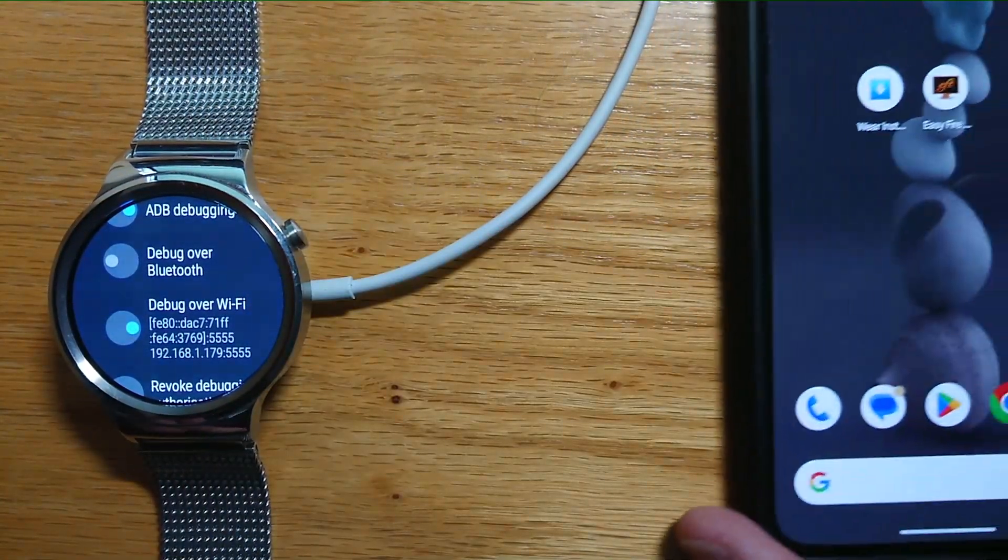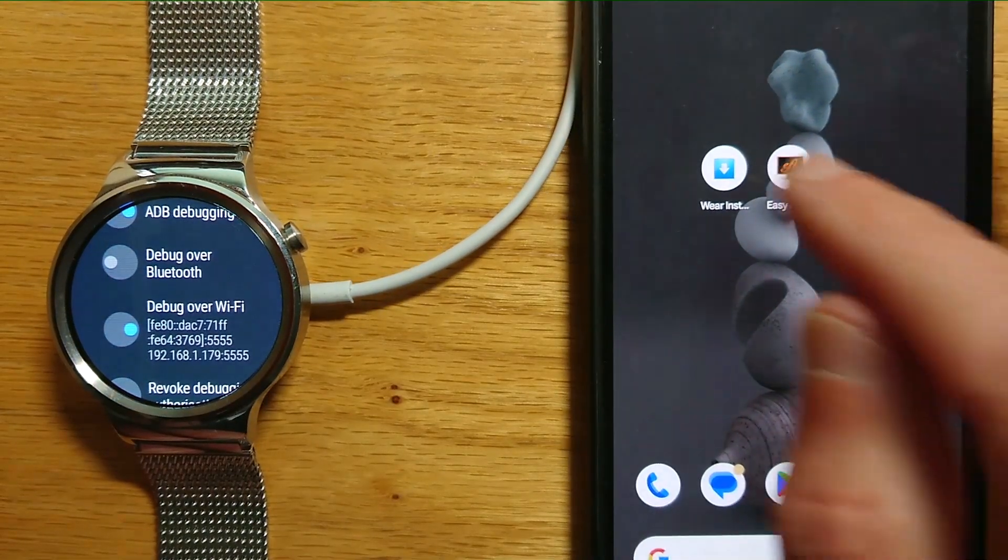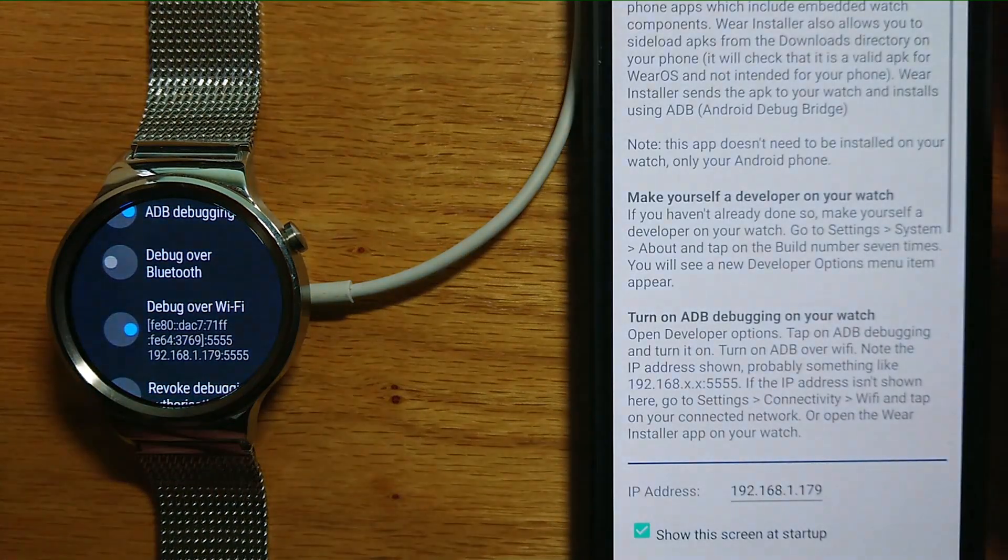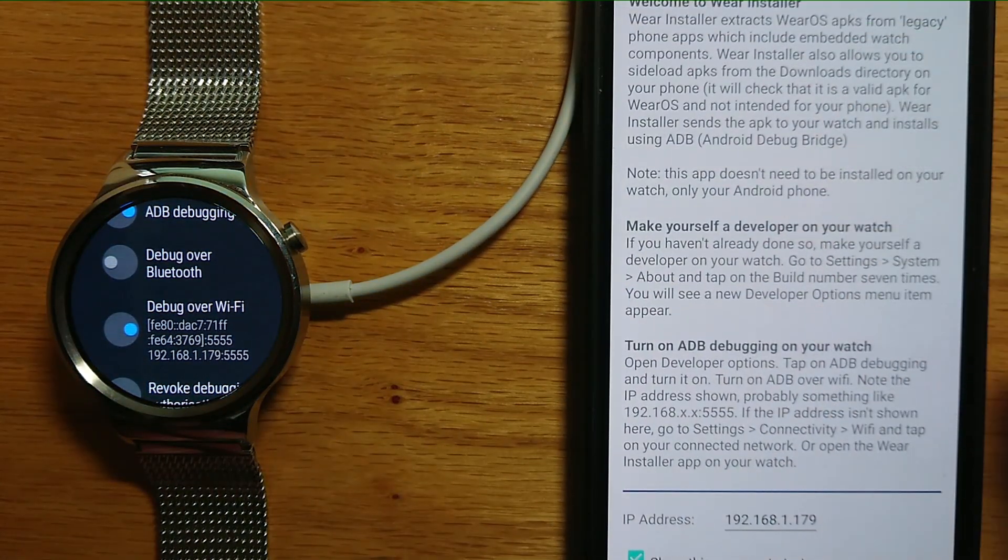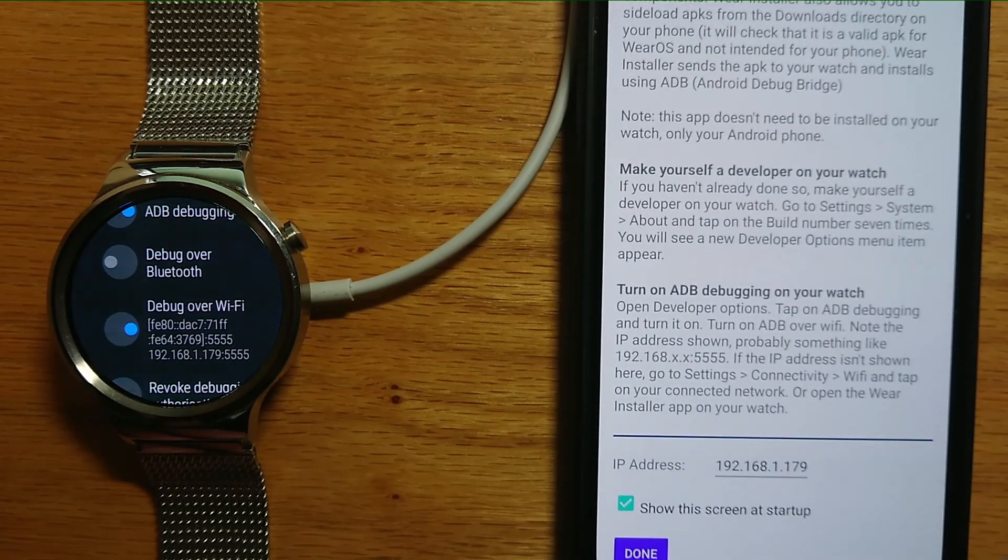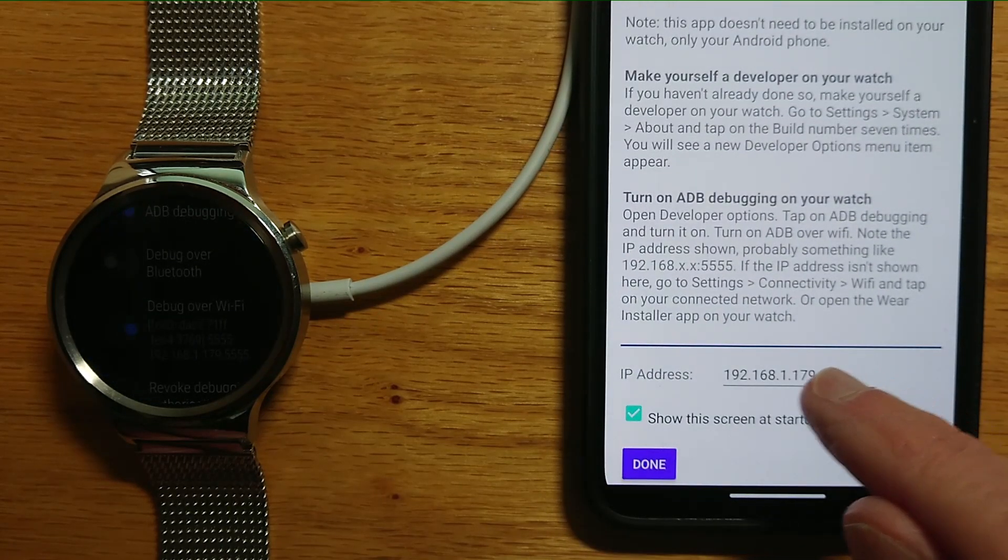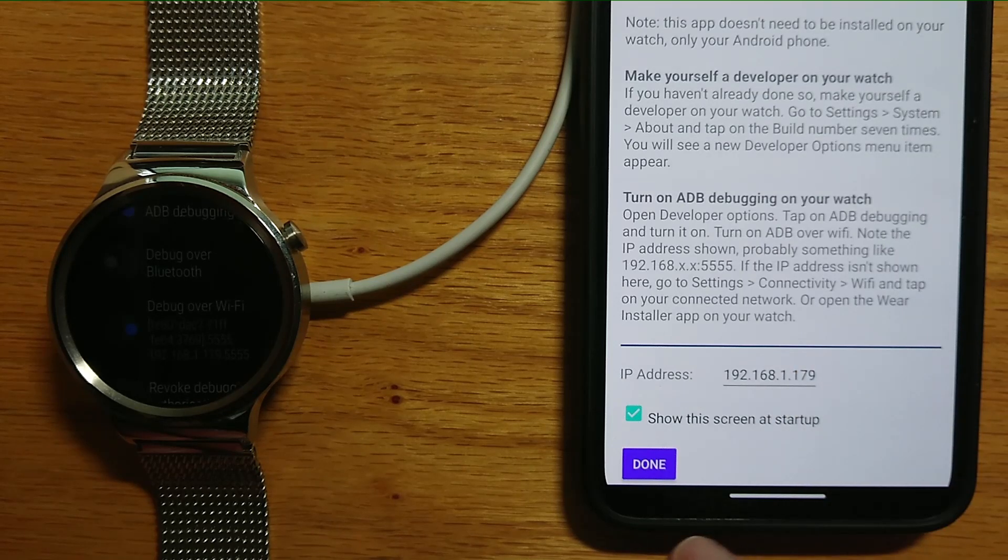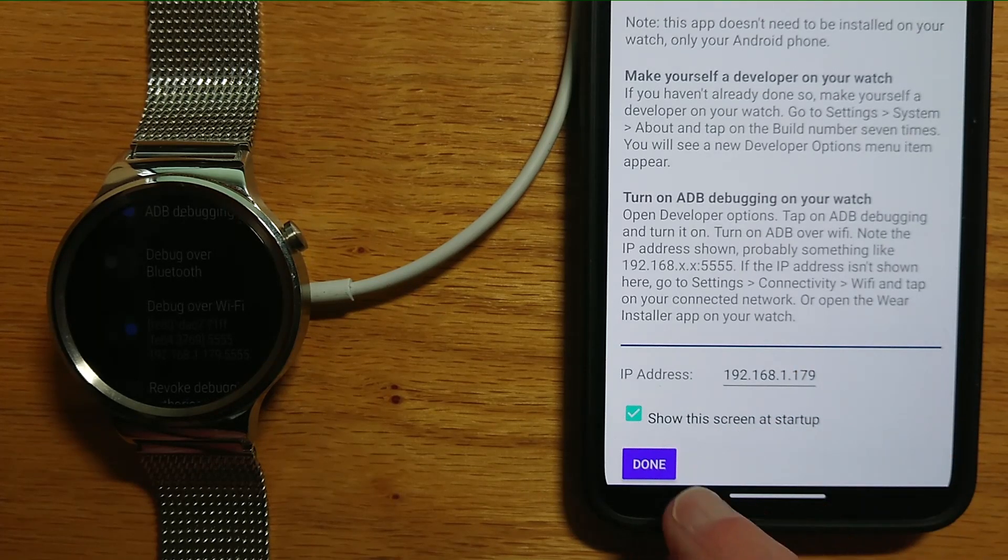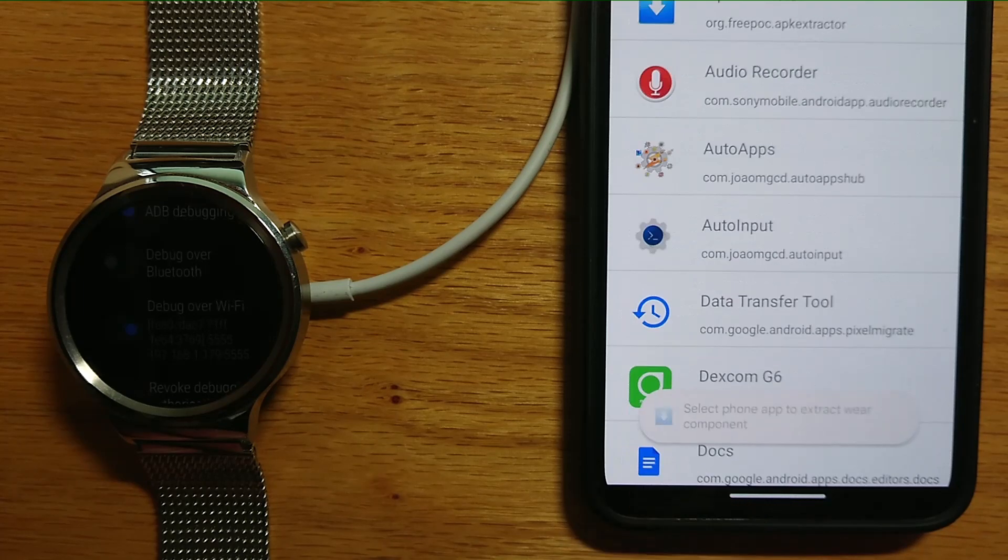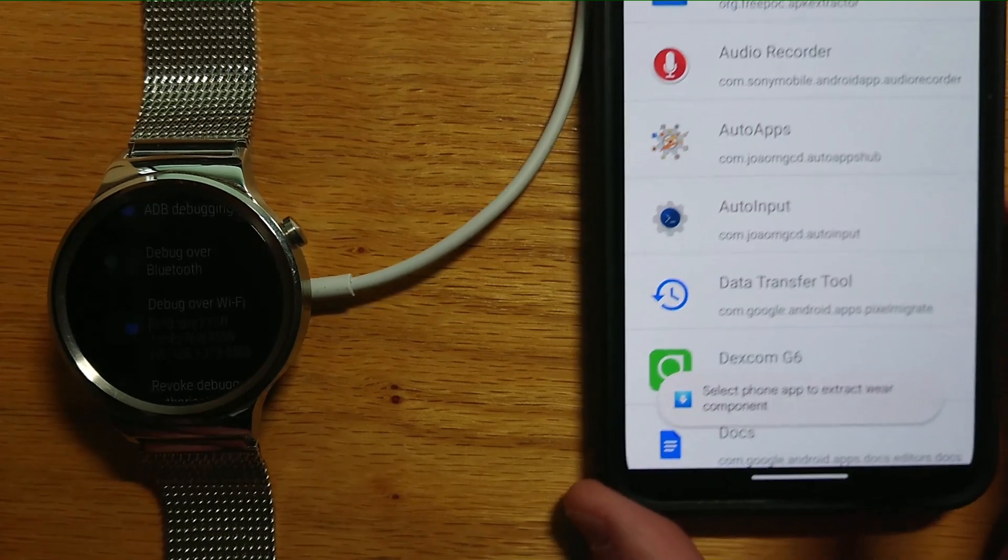Let me bring in my Android phone and open WearInstaller. There's some explanation about how it works, but the important thing is to make sure that the IP address of your watch is entered in this field. You can see I've already done it, and then press Done.